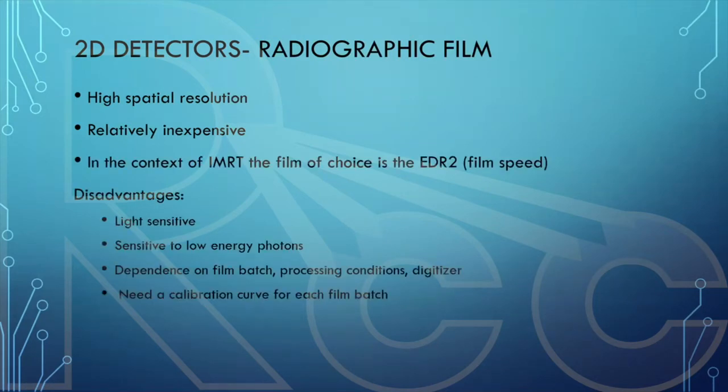And in the context of IMRT, the film of choice is the EDR2. This is because they are able to provide a linear response up to like 500 centigray, if I recall well. In our clinic, we don't have a film processor anymore.